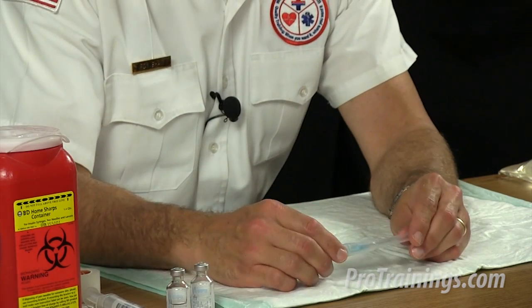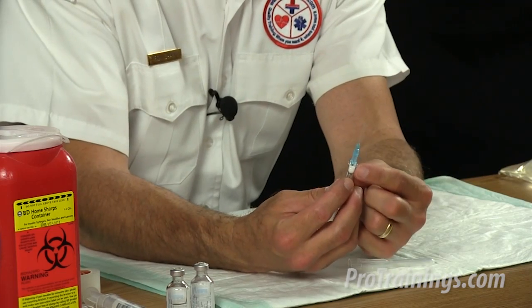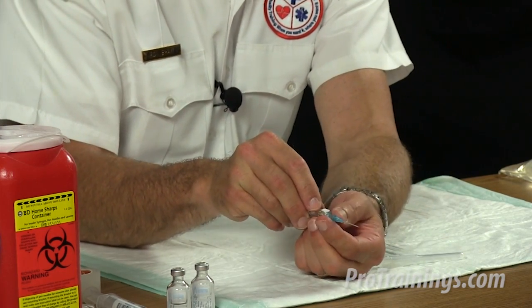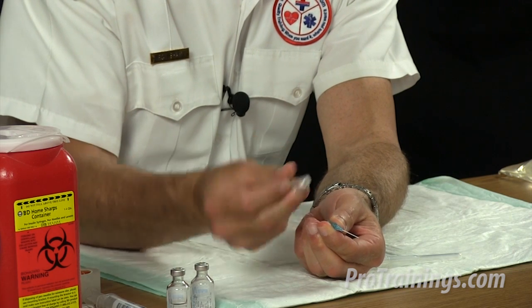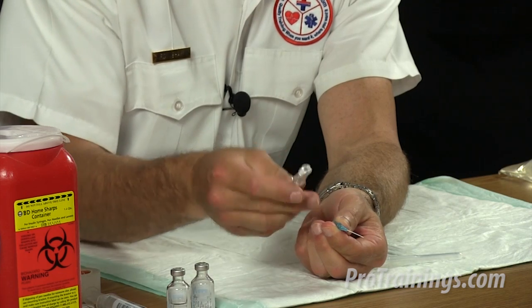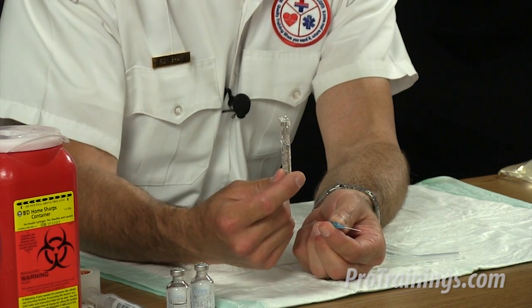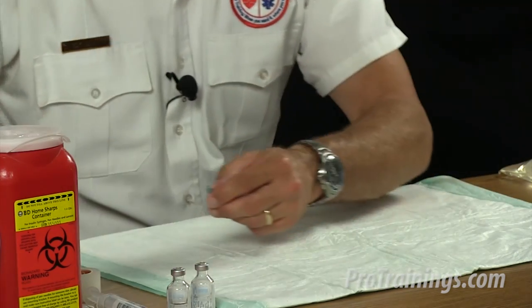So an angiocath, for example, as you can see, it has this button here that once we've inserted the actual catheter into the vein, we can actually withdraw the needle while the catheter stays in the vein, and now we have a very protective covering over this needle so that we can dispose of it in the sharps container and we don't run the risk of getting poked.